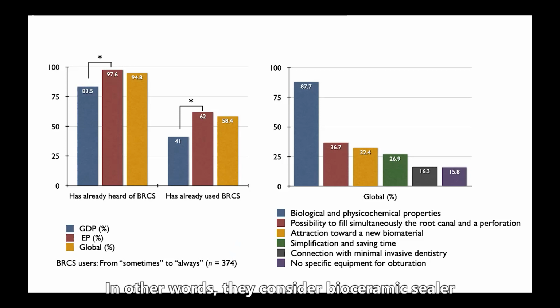In other words, they consider bioceramic sealer has the ability to repair perforation without harmful effect on the periodontium. Some dentists expect to save the filling time or simplify the equipment. Anyway, we can recognize that lots of dentists already have a positive stance regarding the bioceramic sealer.